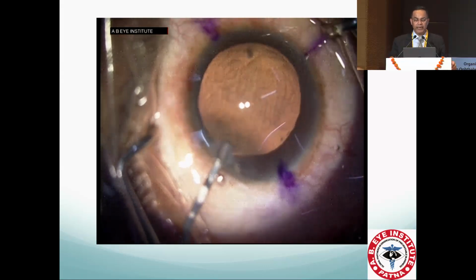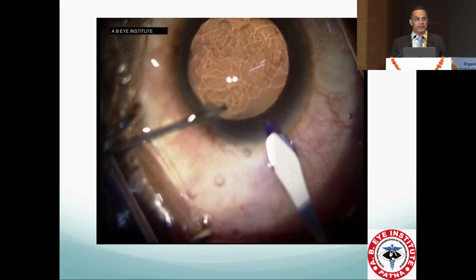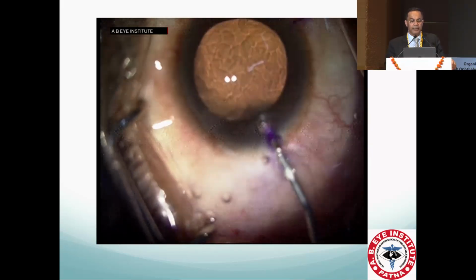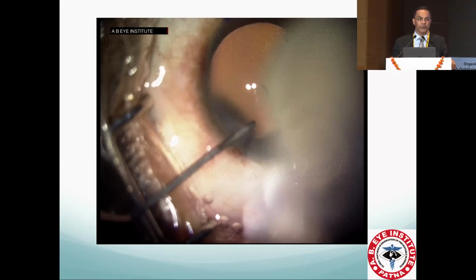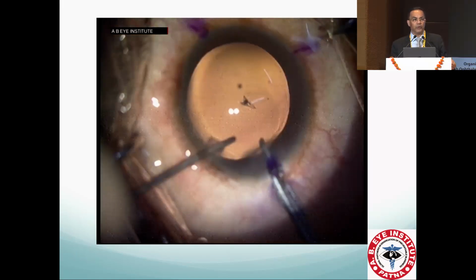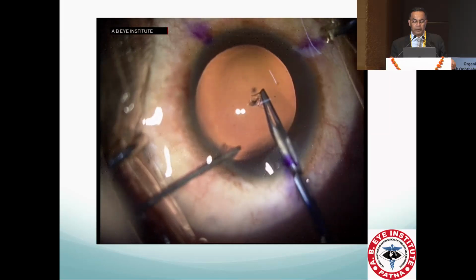You have to be very careful, because in these patients the anterior capsule is very rigid. So if it runs out in young patients, then the placement of the premium IOL will also not be good. And these patients will be living for another 70 to 80 years. And then a non-centered trifocal IOL will give her more problems than any comfort.